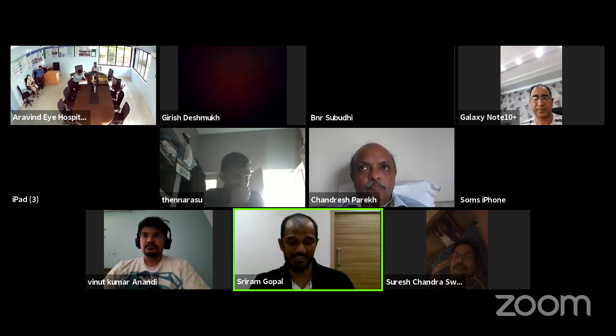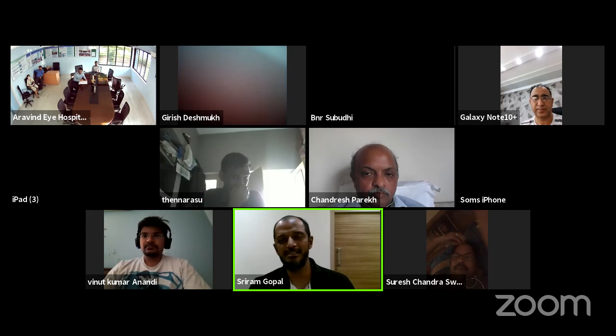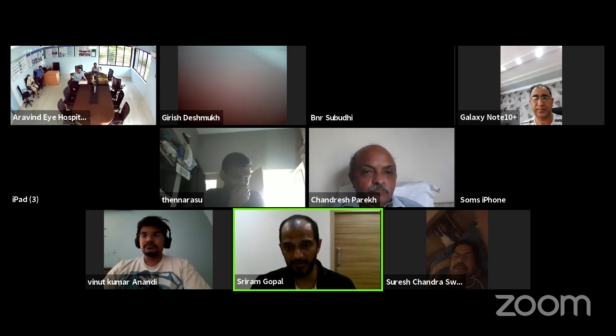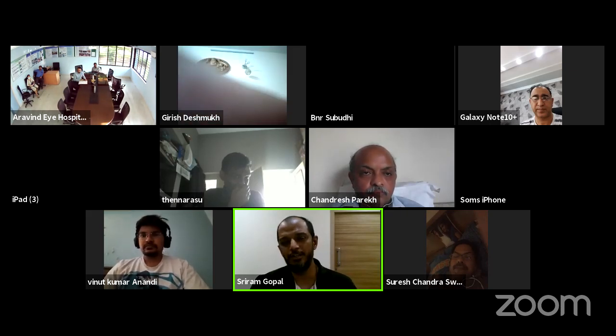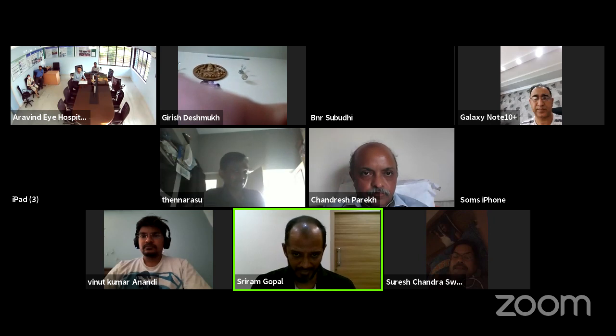So last week, one of the lectures was about the cup to disc size ratio. If you have a very large disc with a physiological cup of around 0.5 or 0.6, that might be picked up as optic nerve cupping. Whereas if you have a person with a very small disc and a 0.8 cup, that is probably not going to be picked up at all. So on B-scan you can suspect optic nerve cupping, but you cannot really conclude that it is optic nerve cupping based on a B-scan alone.